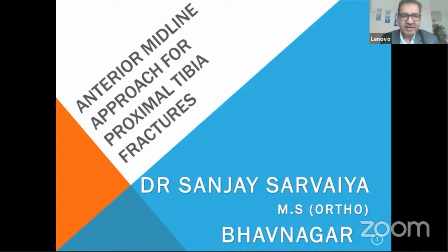So I will be talking on the anterior midline approach for the proximal tibia. If you see a 360-degree dissection of the proximal tibia, probably I'll start at 0 degree longitude. That will be the anterior midline approach.